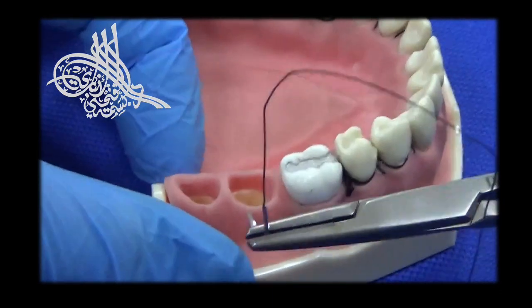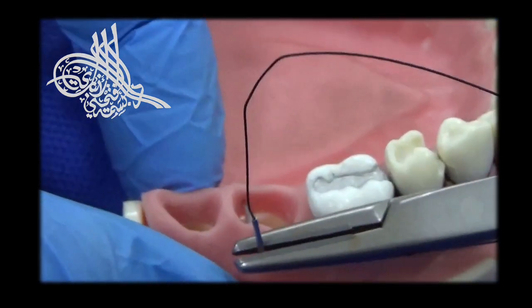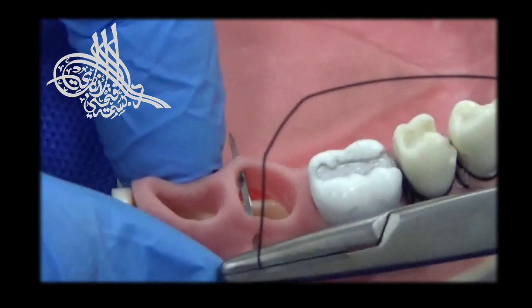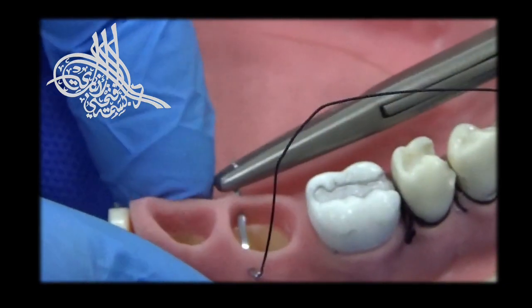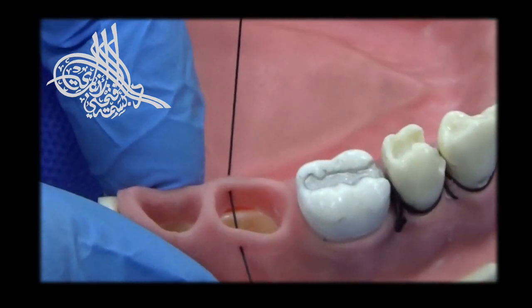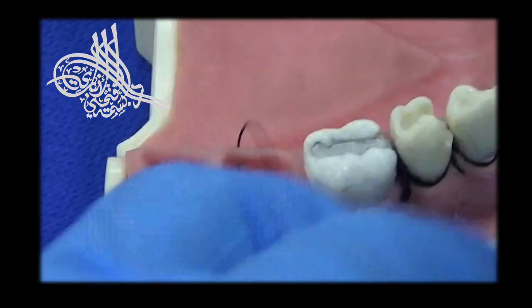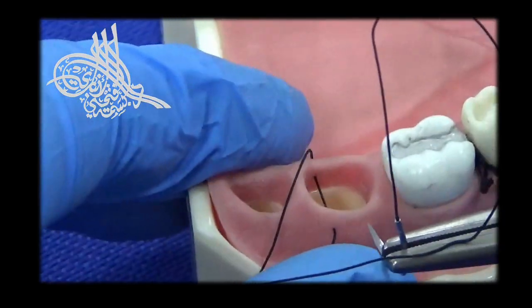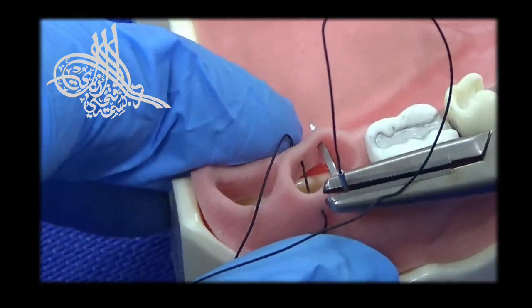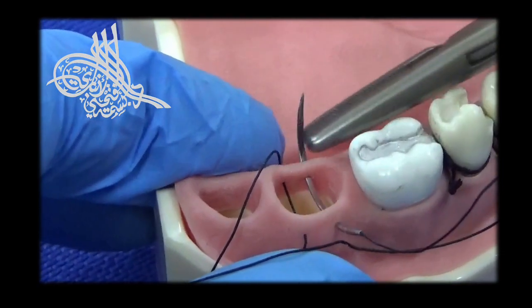In the figure-8 suture, we will enter from the outer side of the first flap, continue to the opposite side, exit and continue back to the first flap to exit from the opposite side.